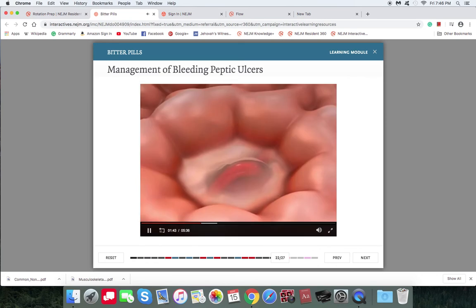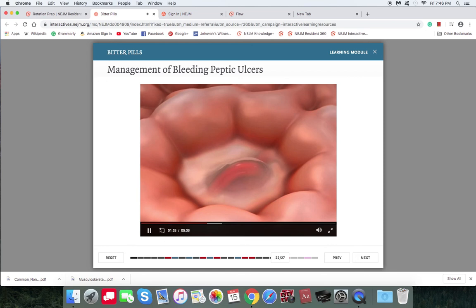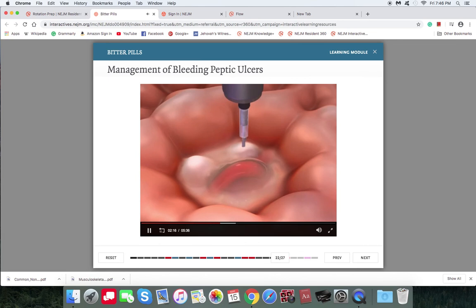Injections are typically made into the 4 quadrants surrounding the bleeding site. Injection directly into the underlying vessel is not recommended. Submucosal injections of 0.5 to 2 milliliter aliquots are recommended, and multiple injections per quadrant are usually performed. The technique of submucosal injection provides a volume tamponade effect plus possible local vasoconstriction and platelet plug facilitation. The endoscopist should observe the raising and subsequent blanching of the targeted and surrounding mucosa.